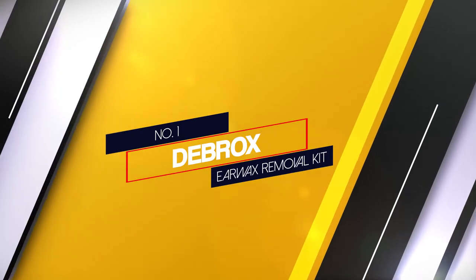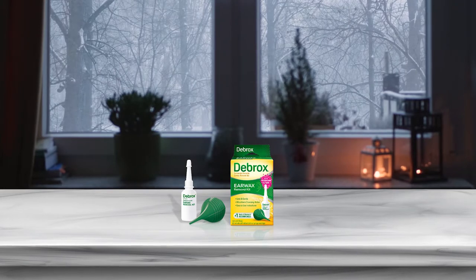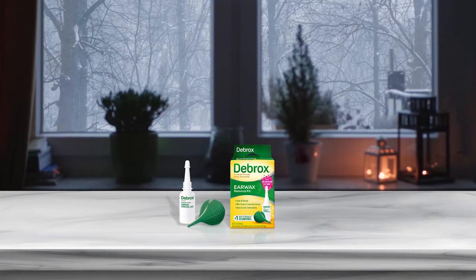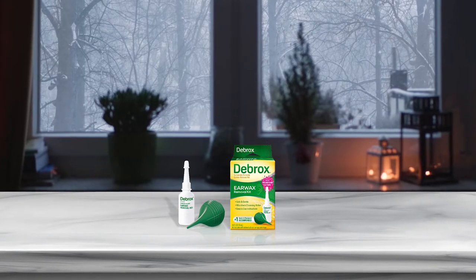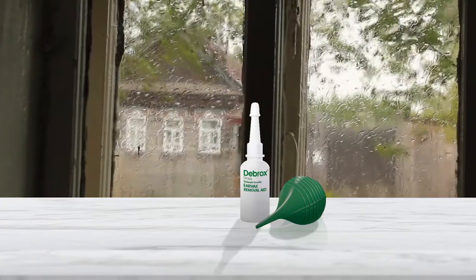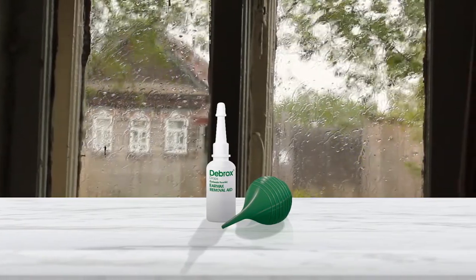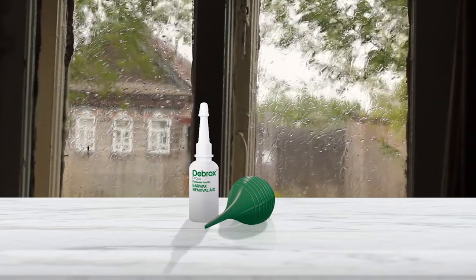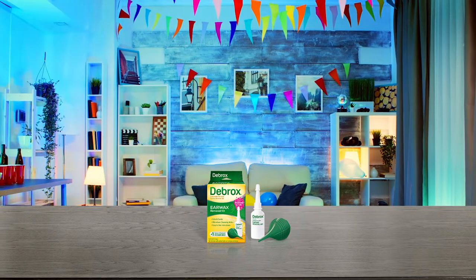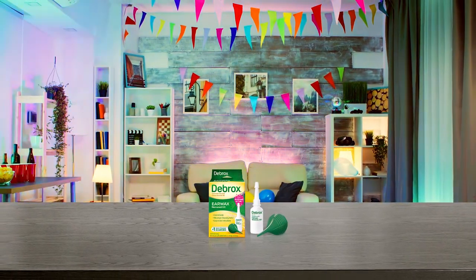Number 1 — Most Popular: Debrox Ear Wax Removal Kit. This is, in my opinion, the absolute best earwax remover kit on the market. It's easy to use and gently softens and releases thick, hard earwax from deep within the ear canal. This kit comes with medicated drops and a bulb syringe. Place a few drops in the ear and allow it to sit for several minutes. The drops loosen the wax, making it easier to come out. Then use the bulb syringe to gently push warm water into the ear.